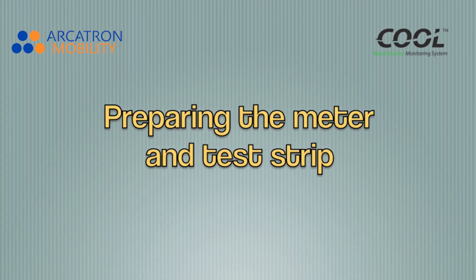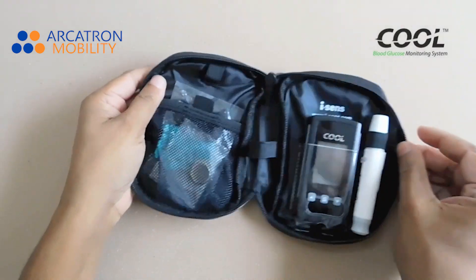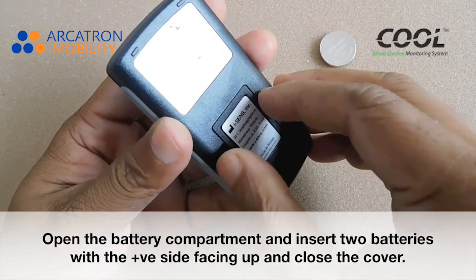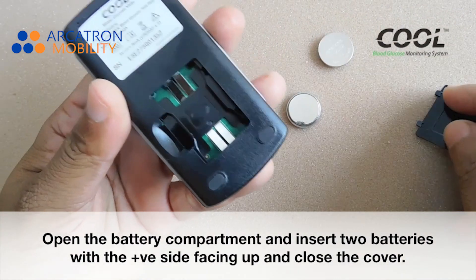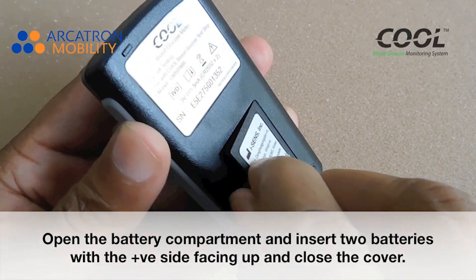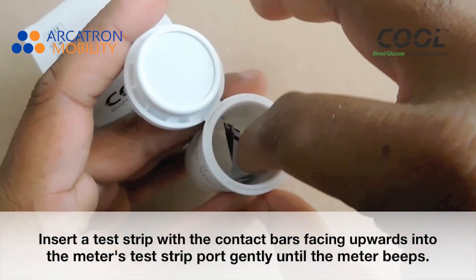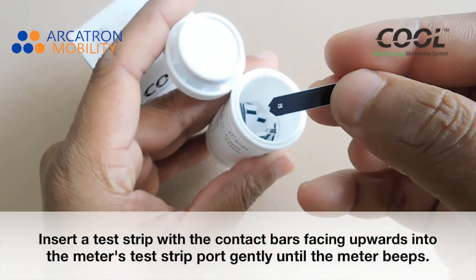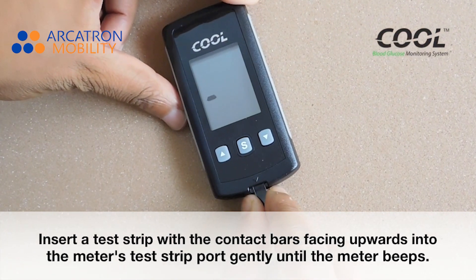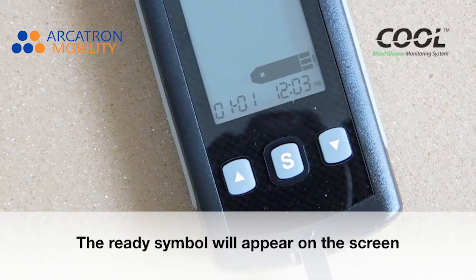Preparing the meter and test strip. Make sure the meter is turned off. Open the battery compartment and insert two batteries with the positive side facing up, then close the cover. Insert a test strip with the contact bars facing upwards into the meter's test strip port gently until the meter beeps. The ready symbol will appear on screen.